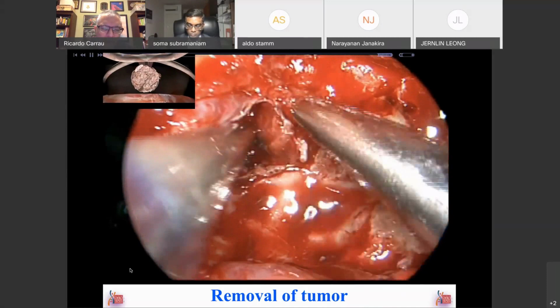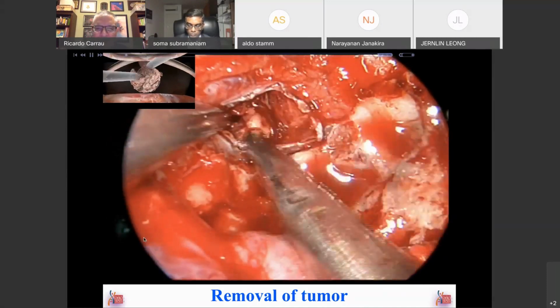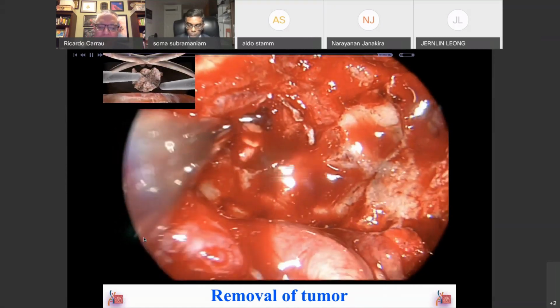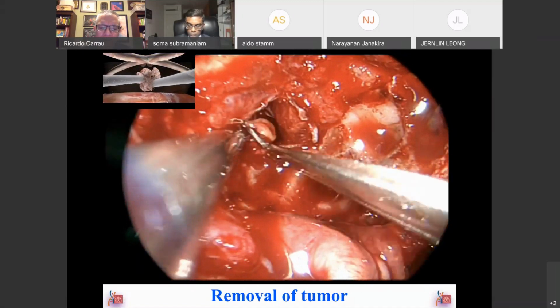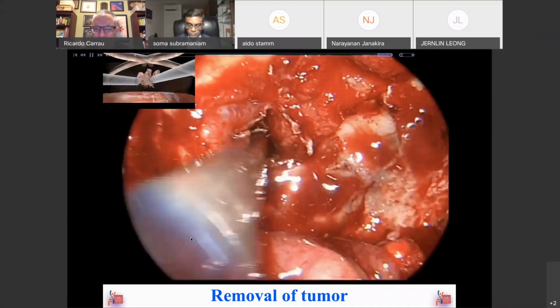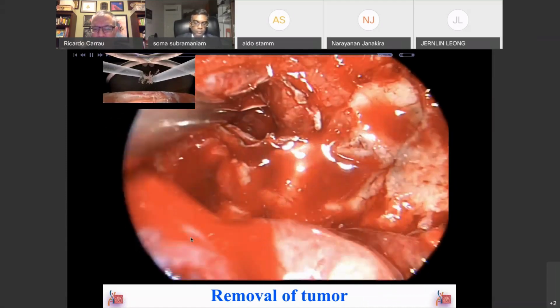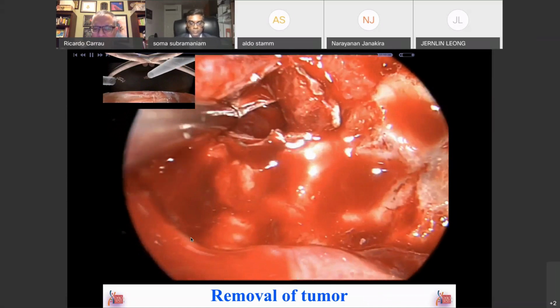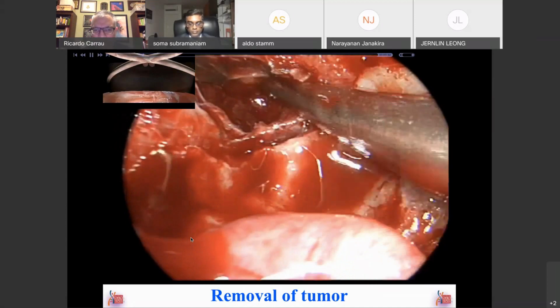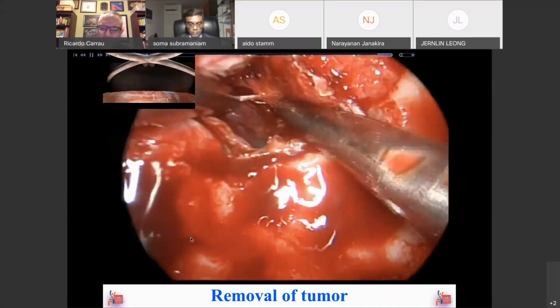When you use the Doppler, you're taking real-life information. So it allows you to have information about the pituitary, about the carotid or some other vessel of interest in a much more secure way. And of course, it's much more inexpensive. A navigation system will run you thousands of dollars, and you can get a Doppler system for less than $1,000.